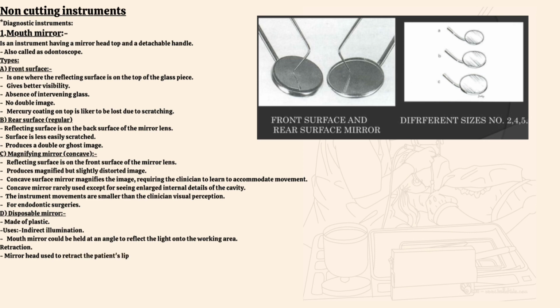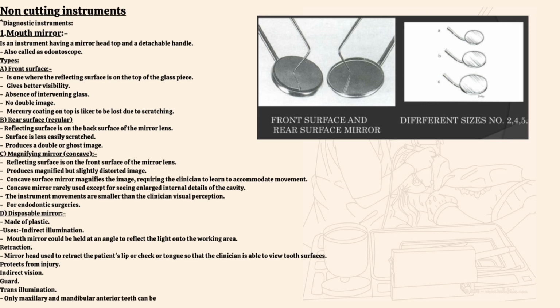Retraction: the mirror head is used to retract the patient's lip, cheek or tongue so that the clinician is able to view tooth surfaces. Protects from injury. Indirect vision. Guard. Trans-illumination: only maxillary and mandibular anterior teeth can be trans-illuminated.